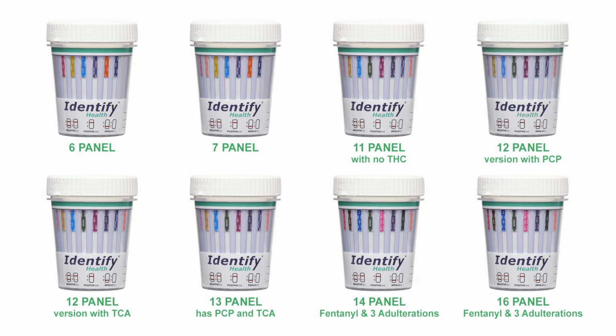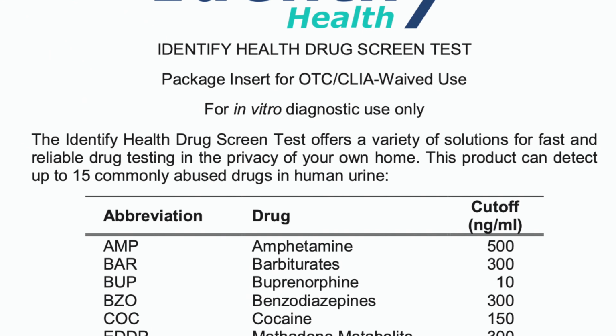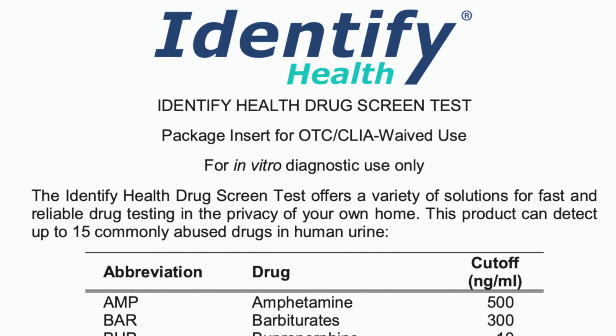Identify Health offers various configurations. This video is for informational purposes only. Please refer to your package insert for detailed instructions.